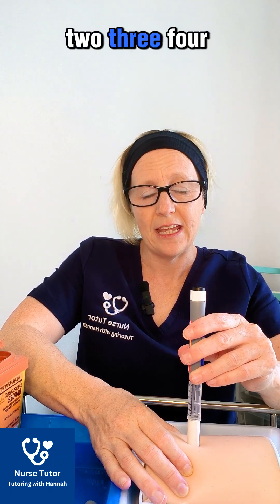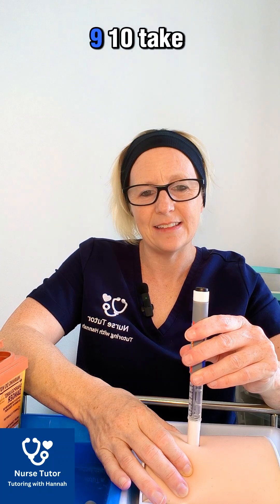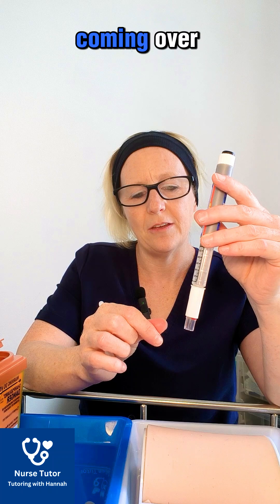Count one through to ten seconds, then take the needle out. You'll hear a click — that is the safety needle coming over.